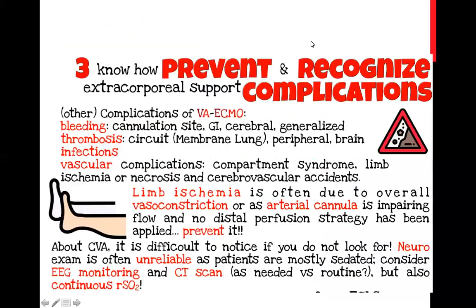Doctor Firas, some article mentions if we can put the LV vent to empty the heart. What do you think of that? Any action is a comorbid action, especially in ECMO. So unless you have a dead, stunned heart that ejects 10, 15, 20%, and you start to have congestion in the lung, you do not insert a vent. Especially with a peripheral ECMO, you would have to insert the vent either through septostomy, which is a very comorbid procedure, or through a mini thoracotomy into the right superior pulmonary vein. So I would really avoid further insult to the patient and causing bleeding, etc., where we go into another vicious cycle. Thank you.